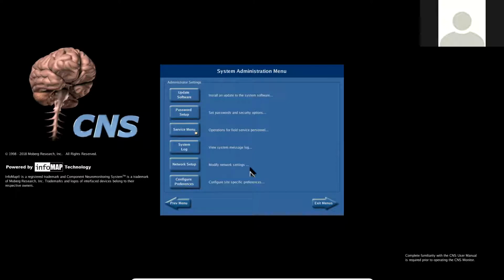And then also we need input from whoever's going to be looking at the data, the physician side, the researcher side, the EEG folks, whoever that's going to be, to determine what it is they actually want. And it's a bit of a project because they have to reserve space on the servers where this data is going to flow to, and make sure that there's enough space available and that folks can access it as they need to. So it just really sets up a shared drive.